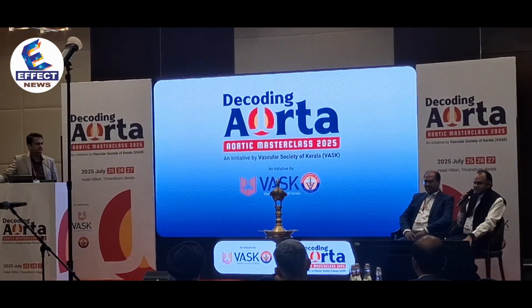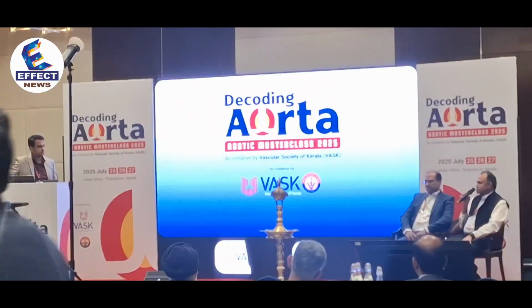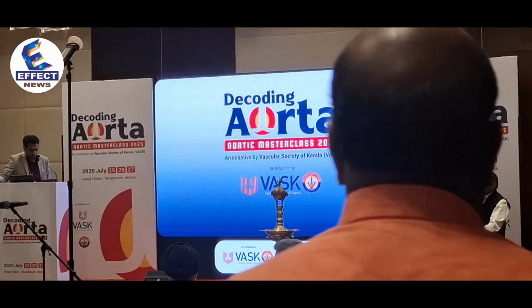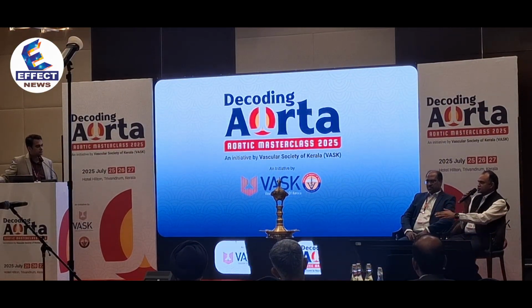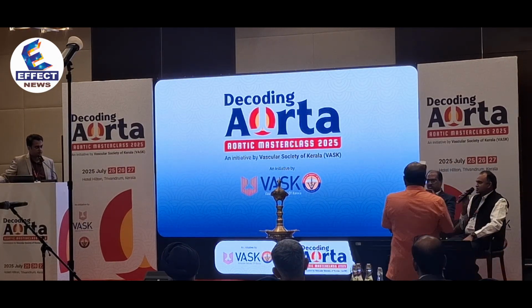Great. So that one is sizing on a plain CT in cases of CKD, if at all. The second is, if a patient comes with a CECT abdomen, would you want a CT angio, or would you be satisfied with that? And the third question is regarding the curved MPR, not available in some places, where you have to straighten it out for the correct measurement. Your views on these three things.